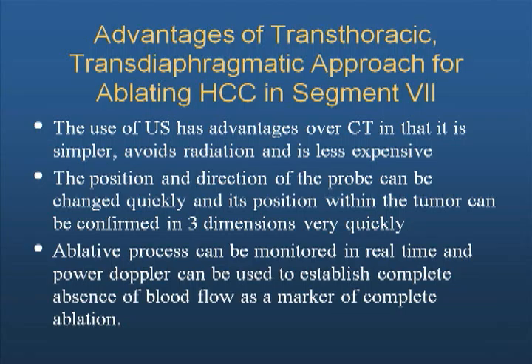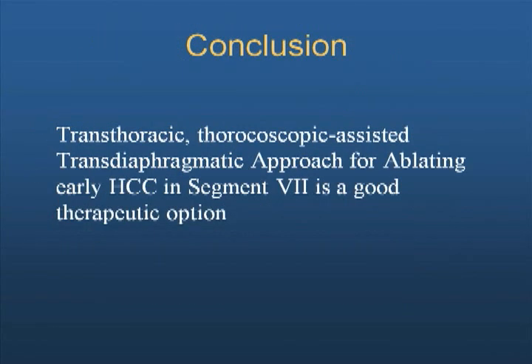Finally, the ablative process can be monitored in real time, and power Doppler can be used to establish complete absence of blood flow as a marker of complete ablation. This video demonstrates that the transthoracic, thoracoscopic assisted, transdiaphragmatic approach for ablating early HCC in segment 7 is a good therapeutic option.